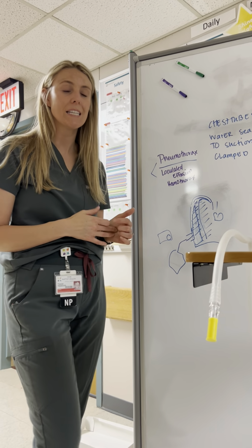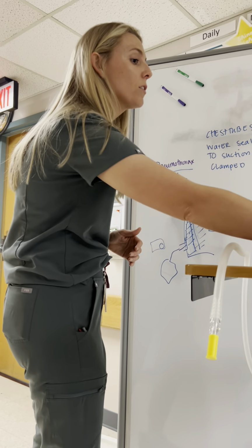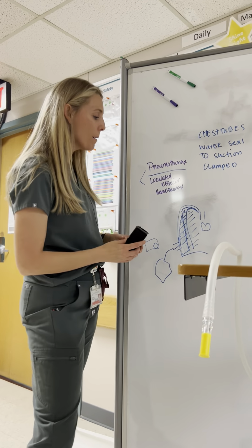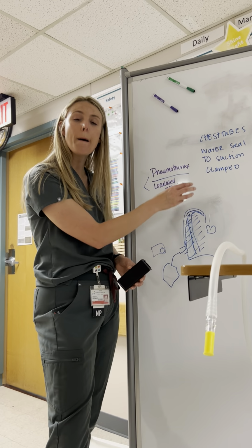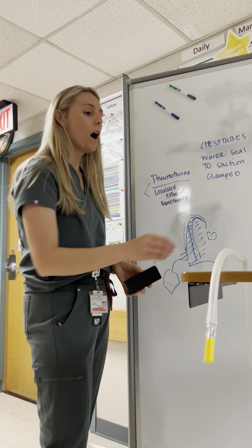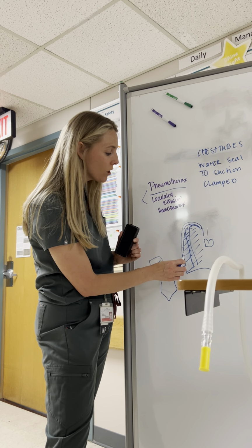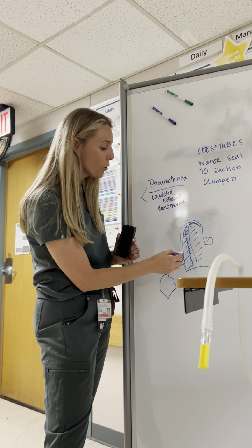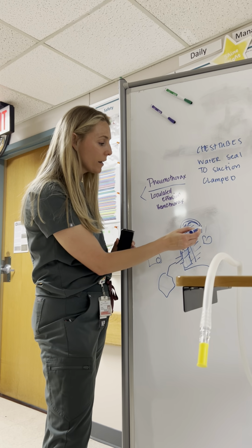But any evidence of an air leak tells you that the pneumothorax has not resolved, and it has an increased risk of developing tension. We have a patient right now who is on a ventilator and on positive pressure, so there's positive pressure always being pushed inside the lung. He probably has some disruption in the lung tissue that's not closed.